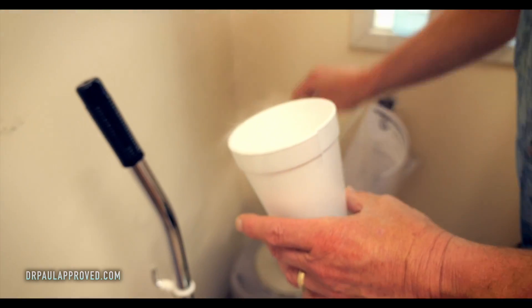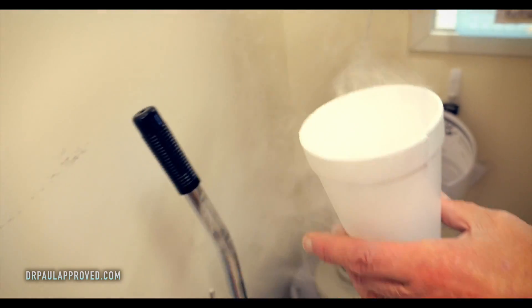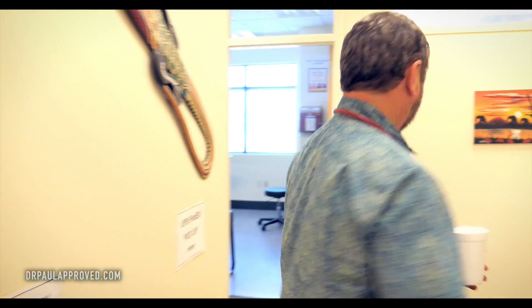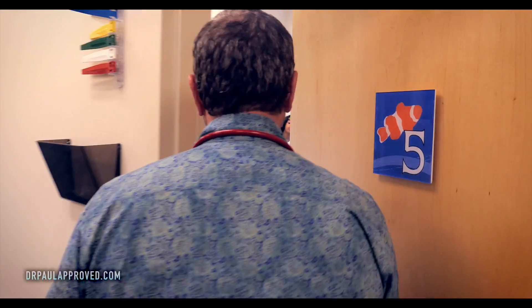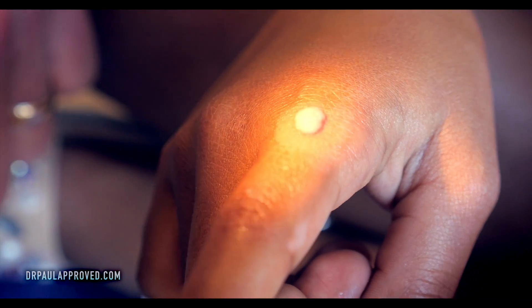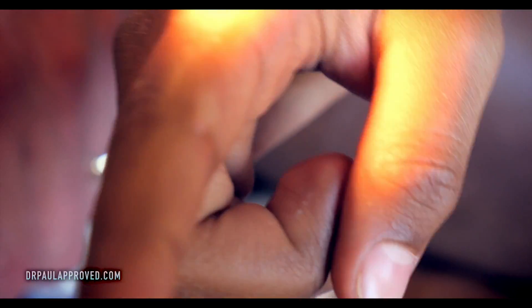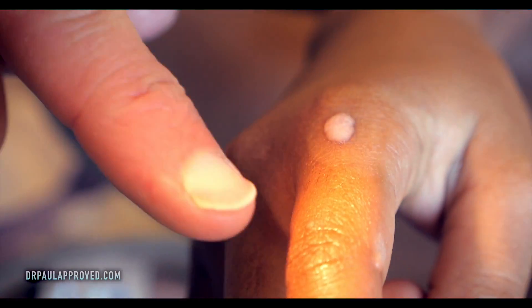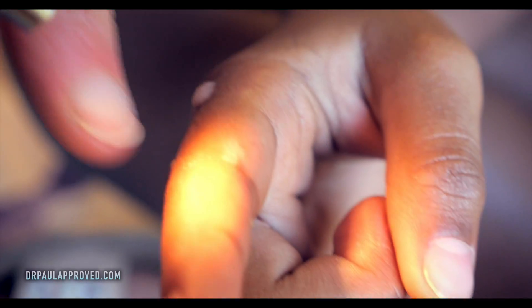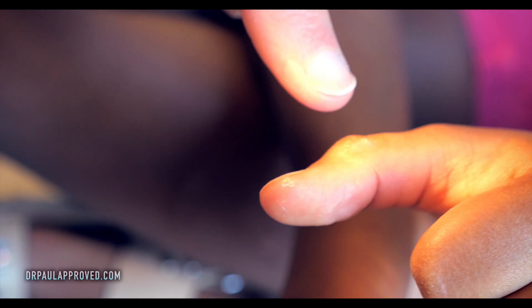She's got more than one wart — maybe I'll get a second dip. That one there is your big one. You think that's been there for a few months or more than a year? I don't know, but I know it's been there for a long time. We've got a couple little ones on the finger there and there, and a little one on that finger there. Tiny little one right there.